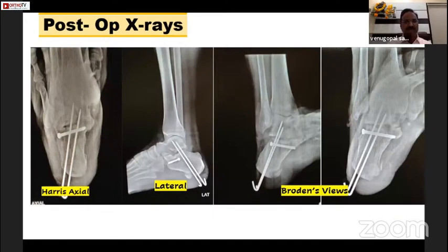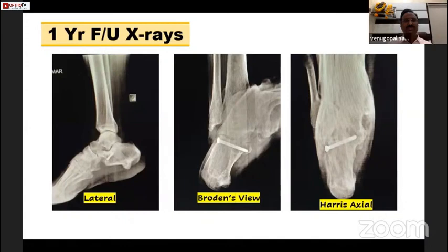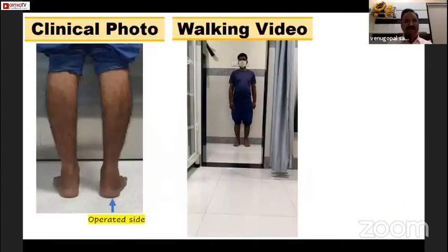These are his post-operative X-rays — Harris axial view, lateral view, and Broden's view. This is the one-year follow-up lateral view. Nicely, the Böhler's angle and the Gissane angle are well formed. There is no evidence of subtalar arthritis. In his clinical photograph, the right side is the operated side — there is no varus at the heel.